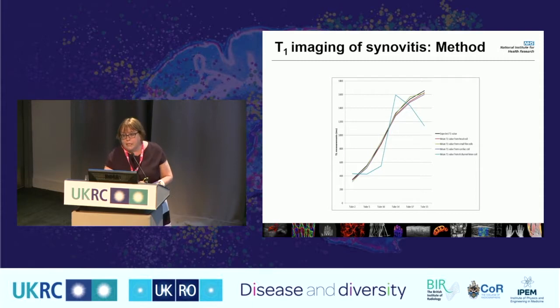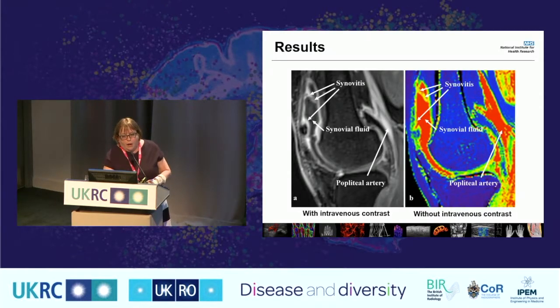The results were exactly the same as the head coil, and it was easy. So we can actually use patients that had big knees or small knees, which again with the knee coil gave us limitations on the size of the knee we could put into the scanner. It also meant we could get the patients as comfortable as possible, and more importantly, we can get the patient's knee into the middle of the magnet. And then lo and behold, we got some pretty pictures.